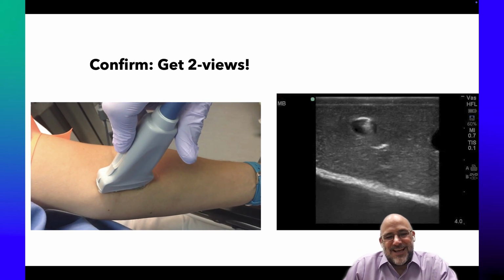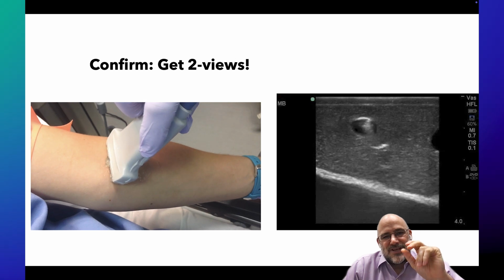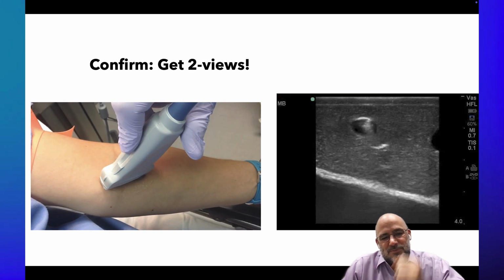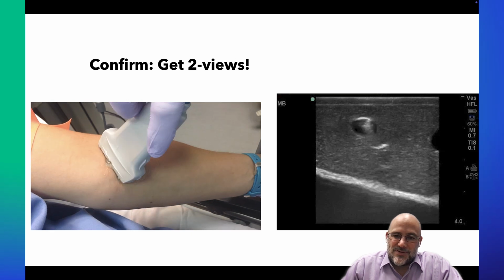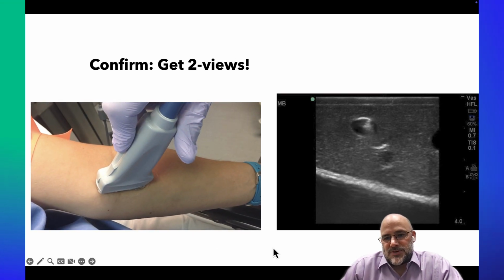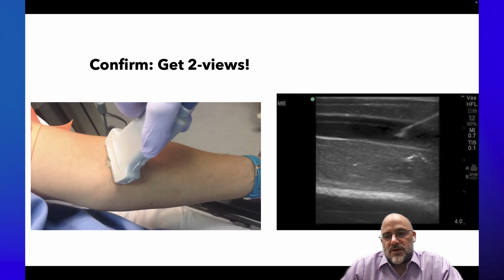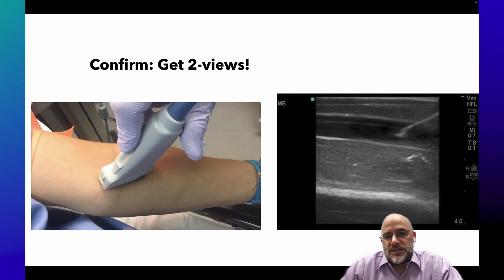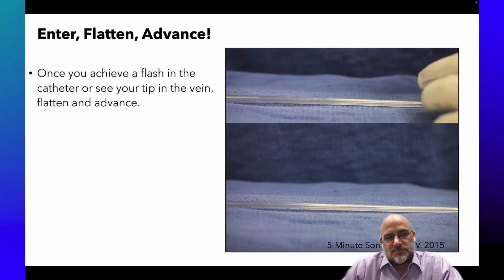That's fine. And then obviously you want to be able to hold the transducer with your fingers on the patient so that you're not putting pressure with the transducer probe. Here this is being done for demonstration purposes. And we'll see essentially what that looks like as we try to keep it in view as we go from short axis to long axis. We can see that we're transitioning there.